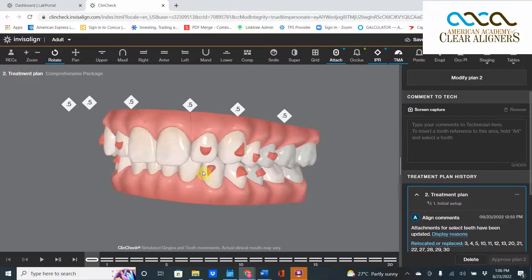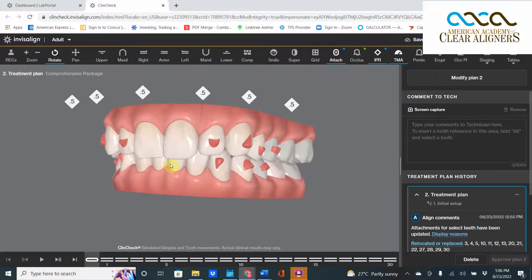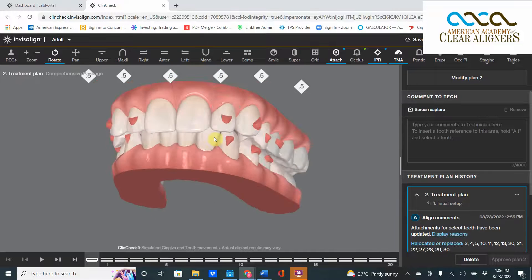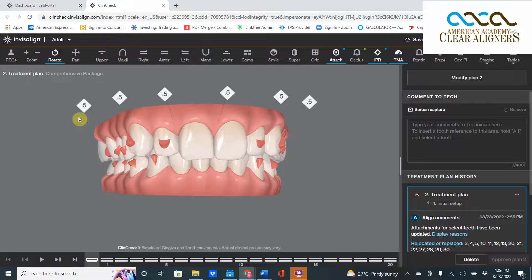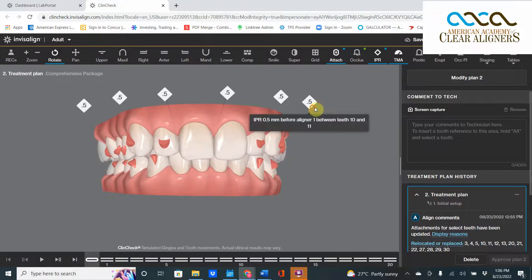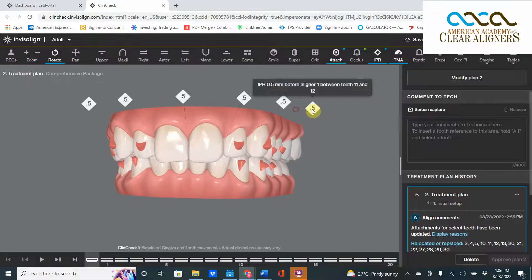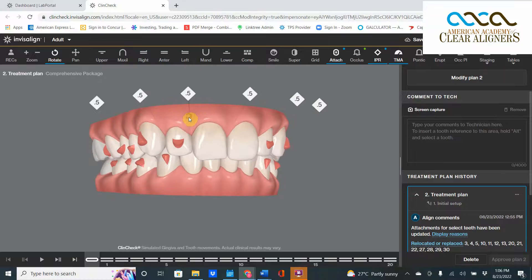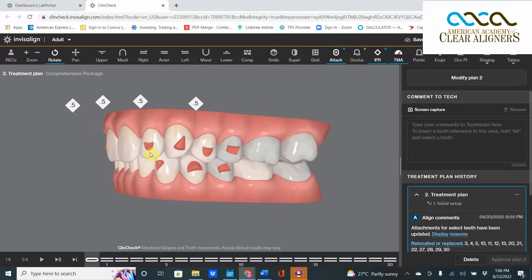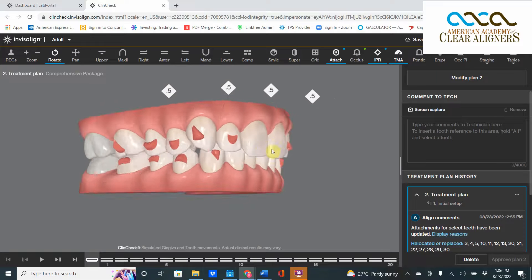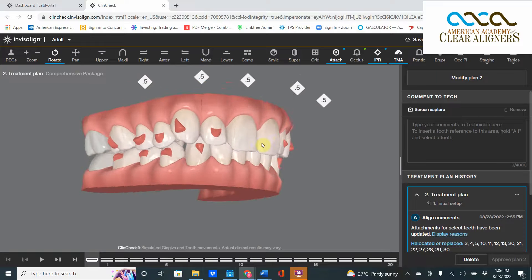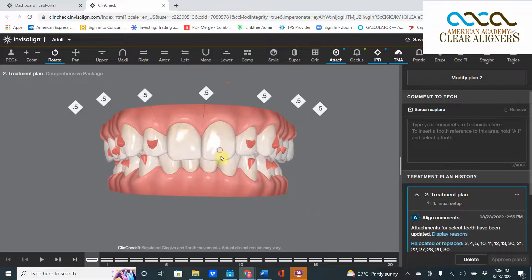We've got Class II on the right side, Class I on the left side, upper crowding, lower crowding with 0.5 millimeters IPR. That makes sense because you have a Class II, but it does seem like a lot because the left side is just Class I. Why is there so much IPR with just the canines rotated out?